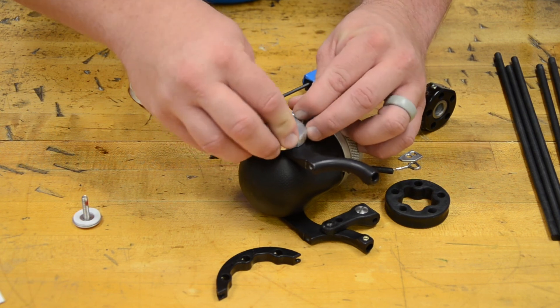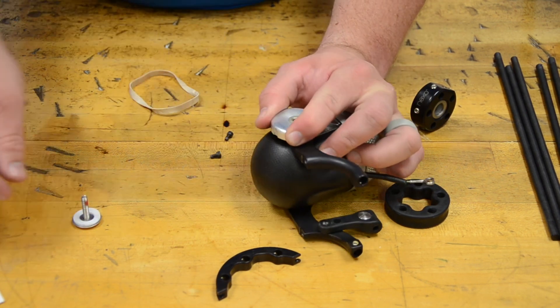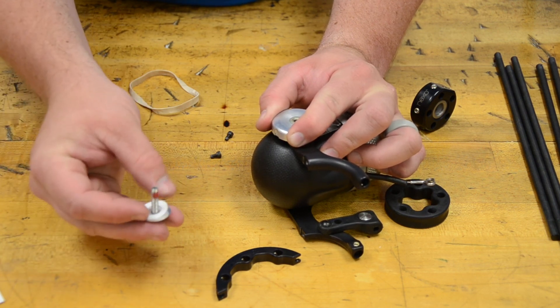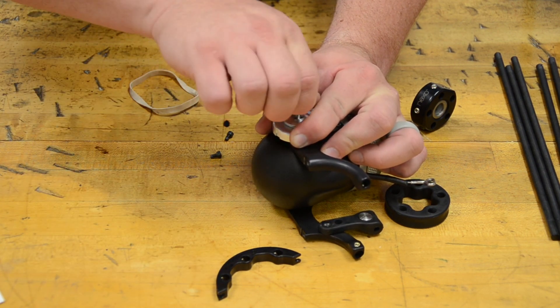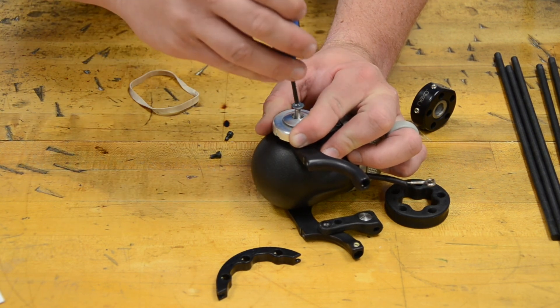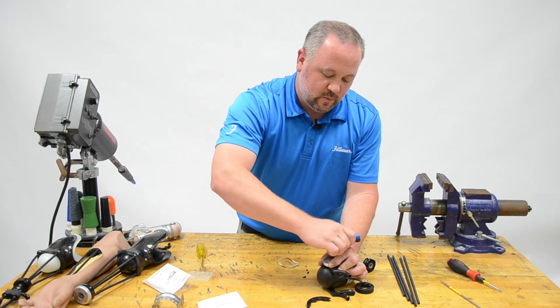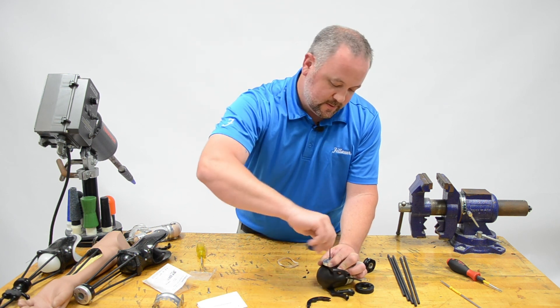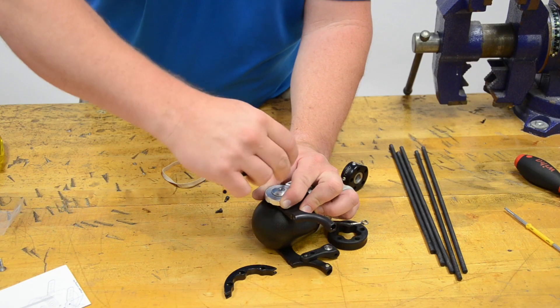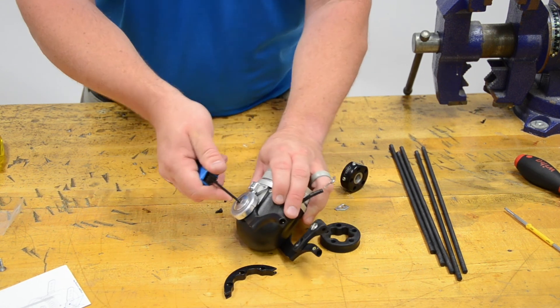Line those up and get everything in place. We have the small friction washer right there — place that in with that. Now tighten this back in. There are a lot of turns on this one.